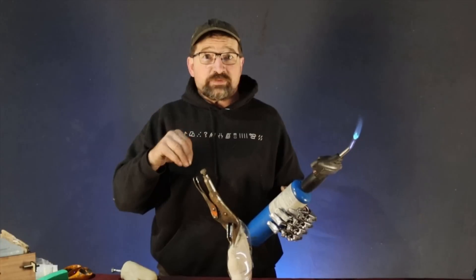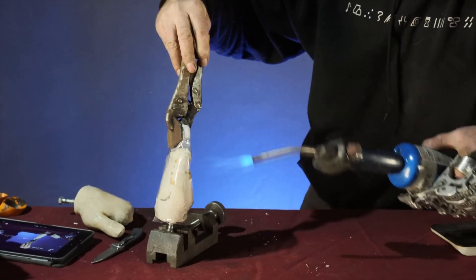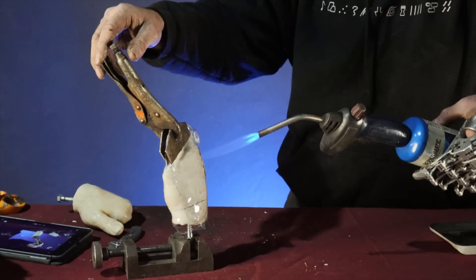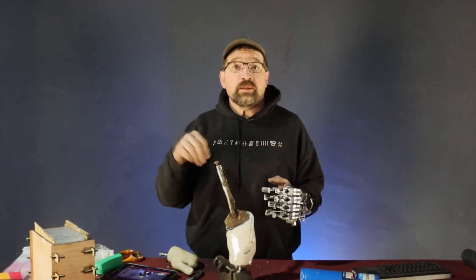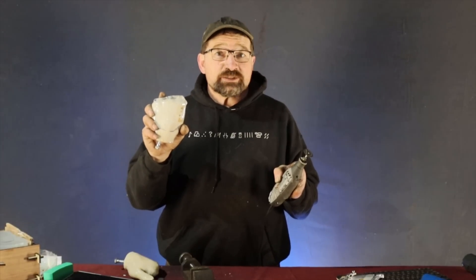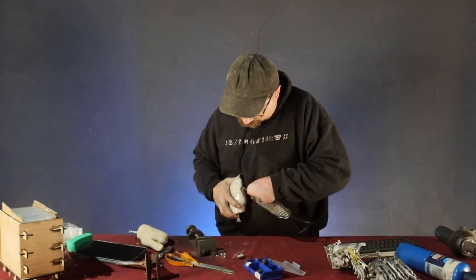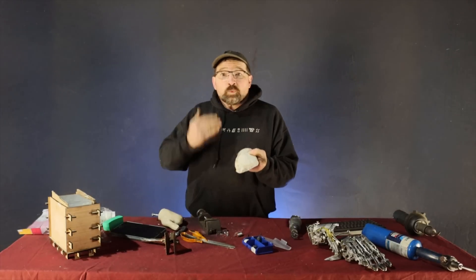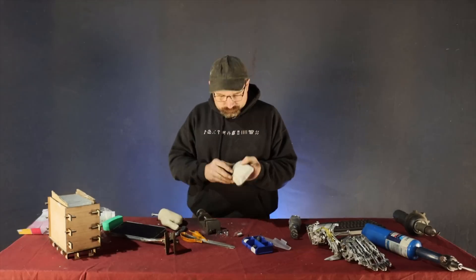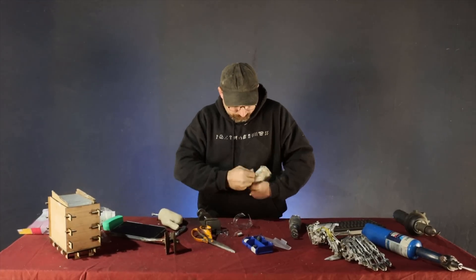Once I have the end crimped I just start shrinking the rest of it until it's pretty even tension. Now that I have the plastic shrunk I'll use a Sharpie to draw the rough profile, and then using a Dremel I'll score the check socket to the marks I made on the plaster so I can remove it and check for fit. When you're trimming the socket it's always a good idea to be on the waste side of the line so you can sand it to a better fit later. With the check socket trimmed you can finally remove the plaster from the shell.